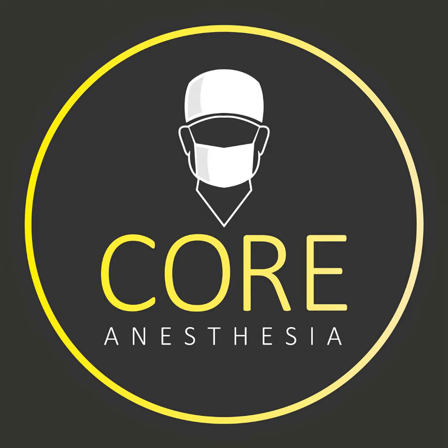So like Cole said, this is such an important monitor because it gives us so much information. And so now that he's gone through and discussed basically the mechanics of this waveform, now let's start to think about what does this actually mean for our patient. So Cole mentioned that first angle. So between phase 2 and phase 3 is your alpha angle. Your alpha angle, you want it to be around 110 degrees.